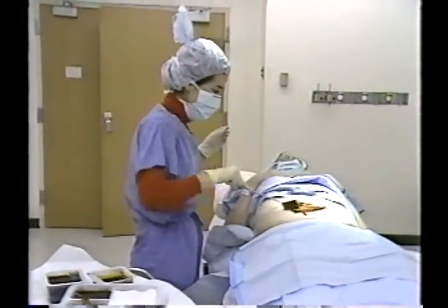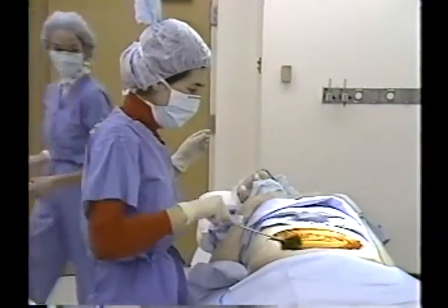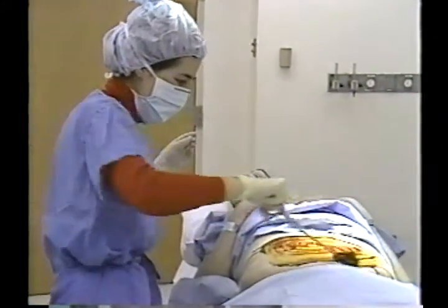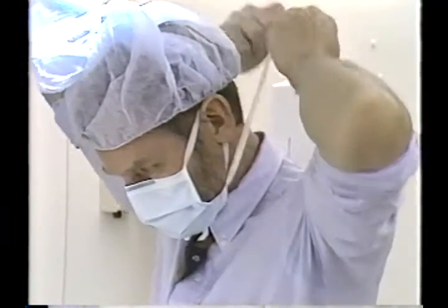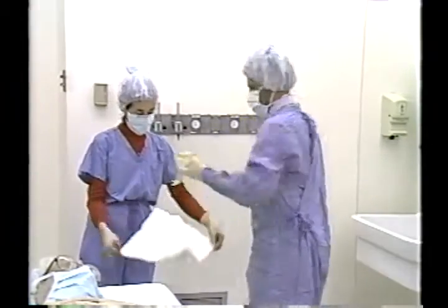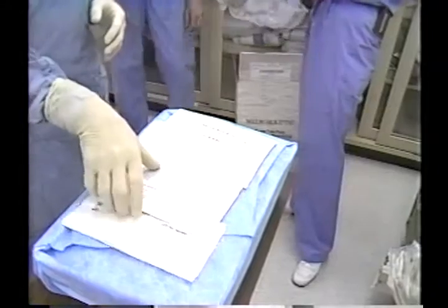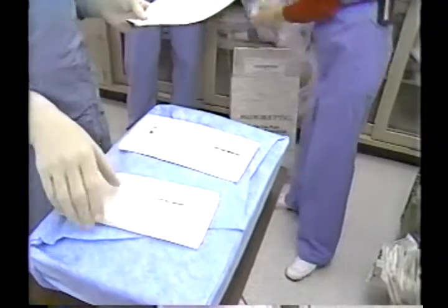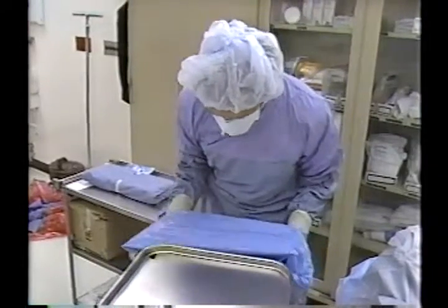The skin is then surgically prepped with povidone iodine. The physician dons hat, mask, gown, and gloves. The deluxe disposable procedure pack is opened. It is completely sterile, CSR wrapped, and is divided into 2 separate trays.